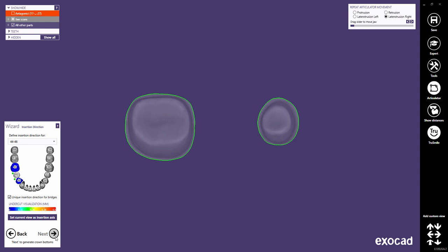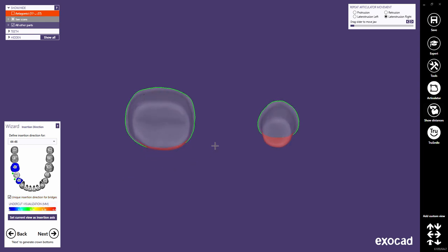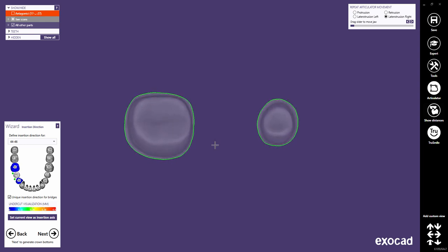As we have changed the material configuration to 3-4 axis mode, we are always prompted by the wizard to verify the insertion direction. Furthermore, the 3-axis mode enforces a unique insertion axis for bridges. Note that in 5-axis mode, you are not always prompted to define or adjust the insertion direction — this only happens if the direction is not ideal. At any point, you can still easily change the insertion direction in the right-click context menu. Rotate the view so that you look into the preparation from the desired insertion direction. While rotating, undercuts are marked in red. Then click Set Current View as Insertion Axis to define the view as the new insertion direction. Click Next to proceed.